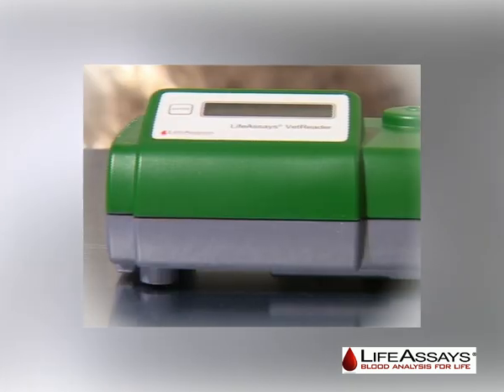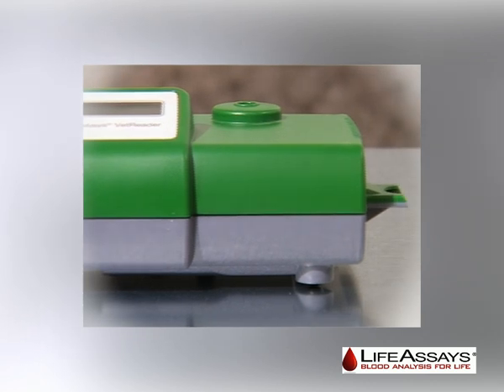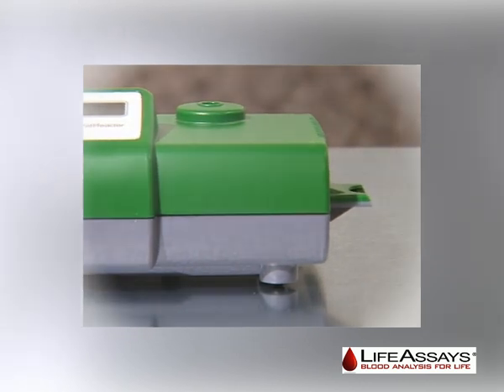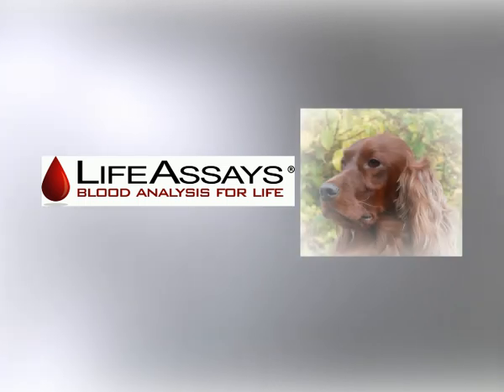For more information regarding Life Assays veterinary products, please refer to the VetReader manual or the instructions for use leaflet provided with the reagent kit. Thank you for choosing Life Assays.